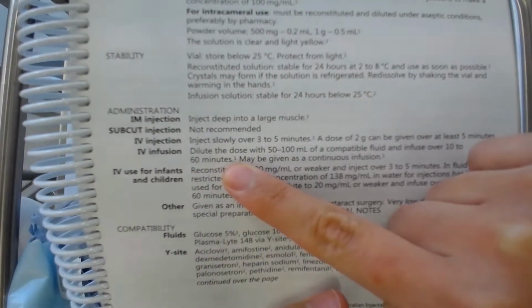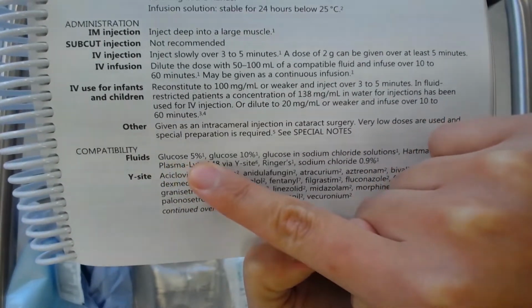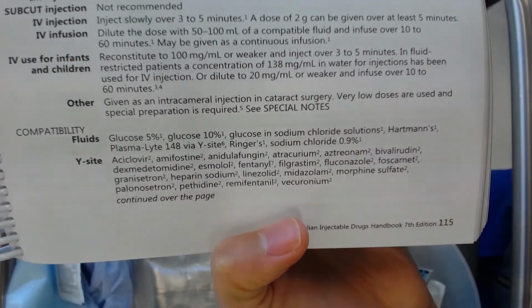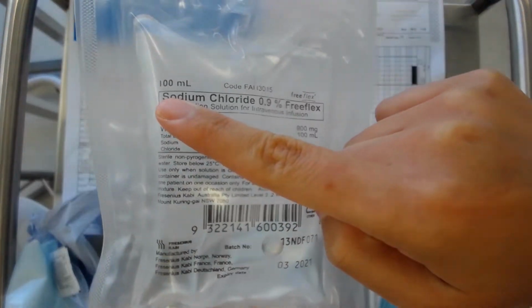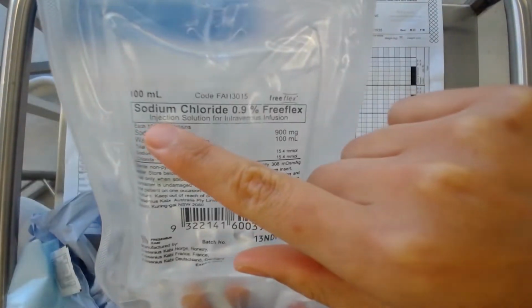Compatible fluids includes sodium chloride 0.9% or normal saline, which is what we have. So 100 milliliters of normal saline. You can check the route in the bag. It says for intravenous infusion.